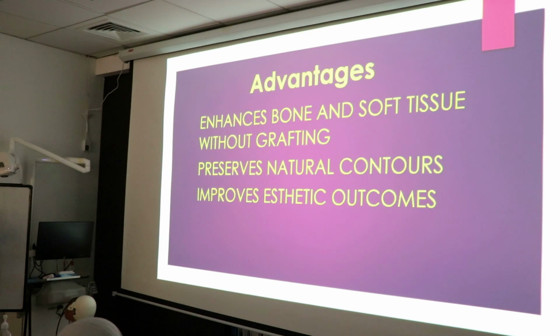These are such advantages, enhances bone and soft tissue without grafting. So it's a non-invasive procedure. Think about it in your practice as such. Preserves the natural contours.